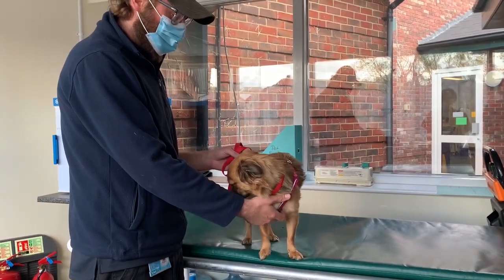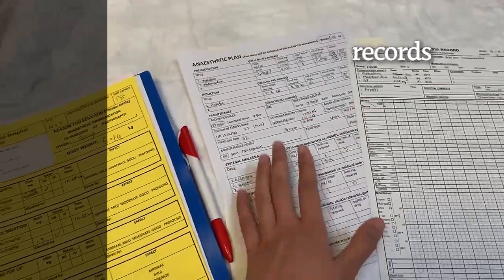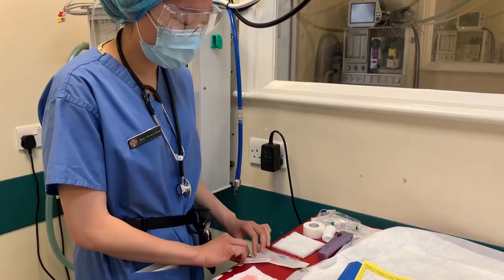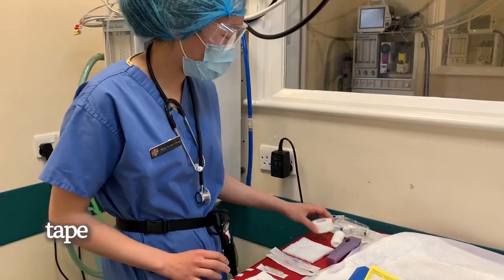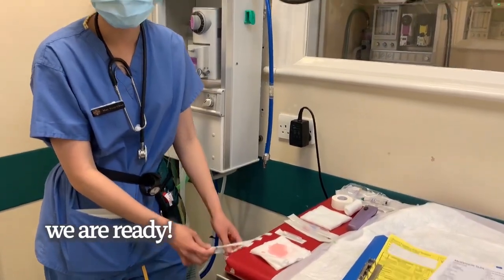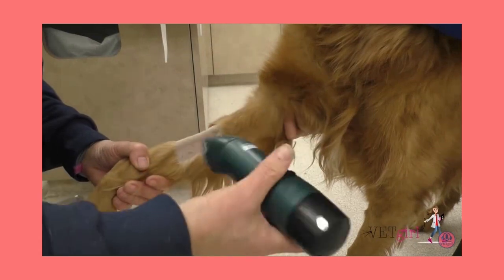As we are on anesthetics today, we prepare the records and monitoring charts, carry out checks on our machine and then admit our patient. We prepare materials to place an IV catheter — we have our catheters, our scrubs, chlorhexidine as well. We've got our concise catheters, some tape, our T-port and a flush. This is done so that we have intravenous access to administer drugs or any fluids that are needed during the operation.